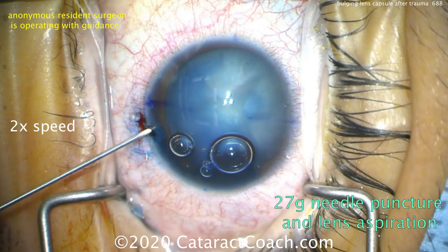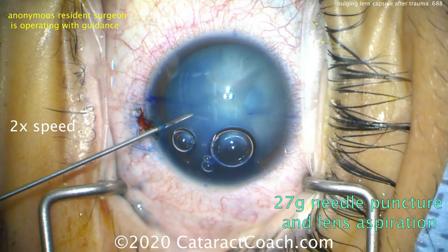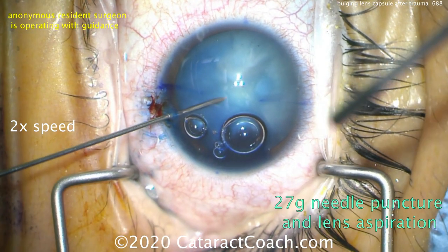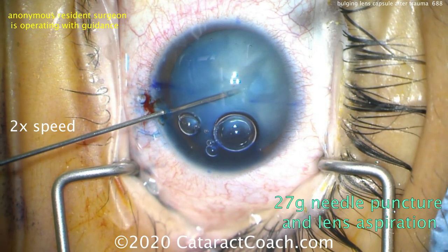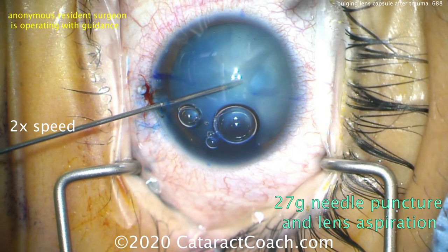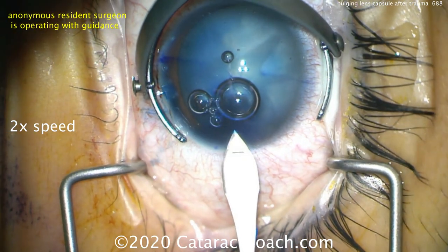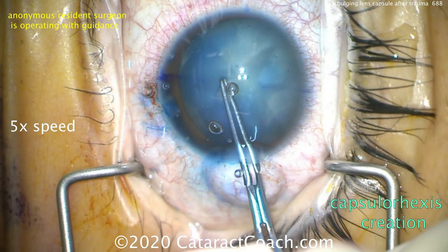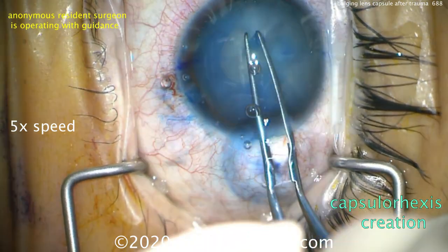A 27-gauge needle is going to be used here to puncture the central lens capsule and aspirate some of this milky white fluid. Poking in bevel down with the 27-gauge needle, puncturing the lens capsule and aspirating on the plunger of that 3cc syringe. Now that the capsular bag is depressurized, the main incision is made and the capsulorhexis can be created.